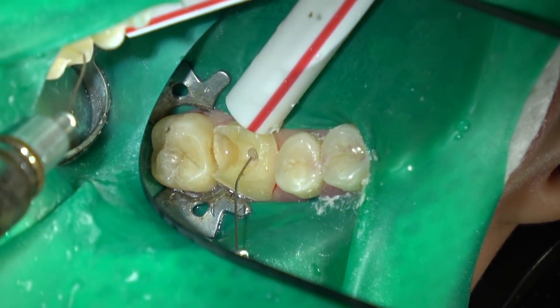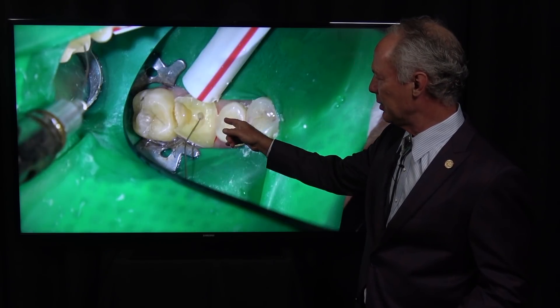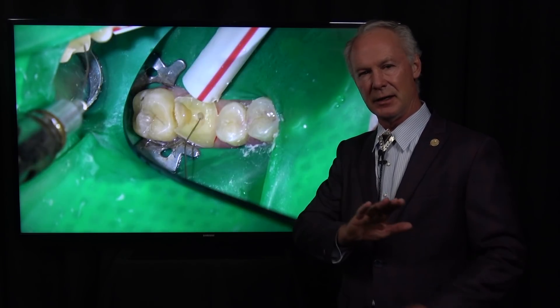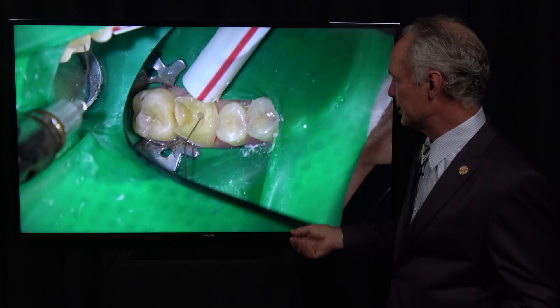There's the nerve of the tooth. Once I find the pulp chamber, I always anesthetize again into the pulp chamber — an intrapulpal injection. So on a maxillary tooth, I've done an infiltration injection, an intraligamental injection, and now an intrapulpal injection. There is no way the patient is going to feel anything. They will sing my praises — not only is the endodontic technique terrific, but they didn't feel anything, and they weren't expecting that.